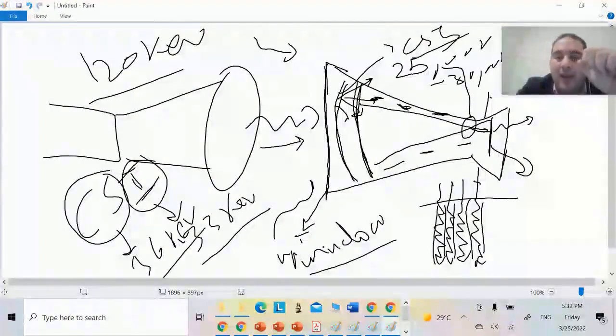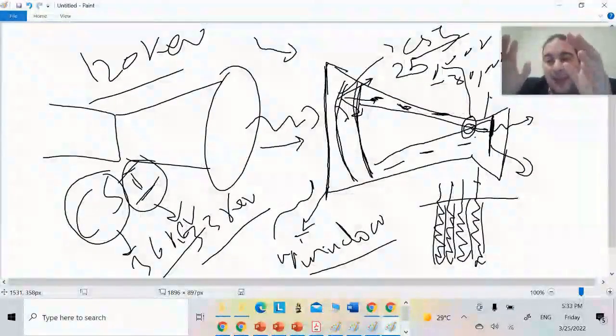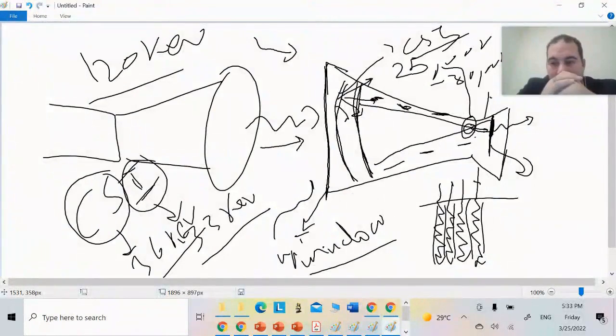Now, what is this anode like? It's like a donut with holes in it, so that after it gets focused and gathers at this point, it starts to diverge like this and begins to fall onto the output phosphor, which is cadmium zinc sulfide, whose attenuation is very suitable for the electrons. So, it starts giving me light photons.